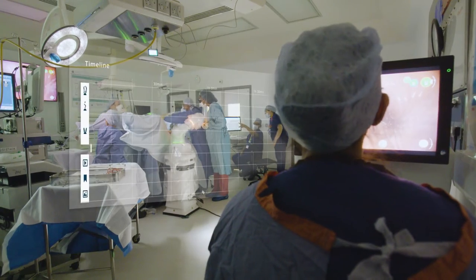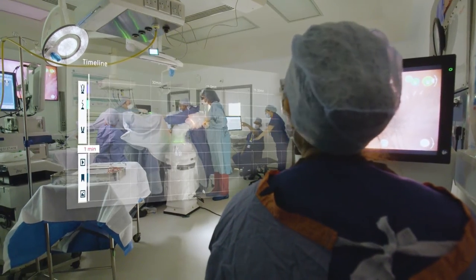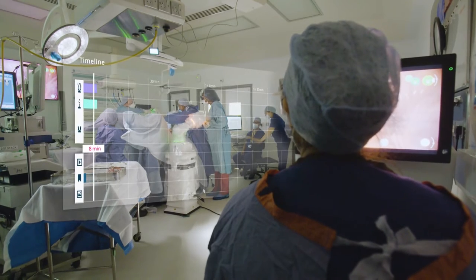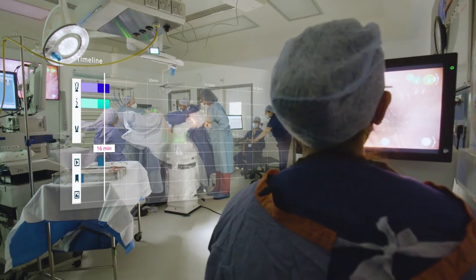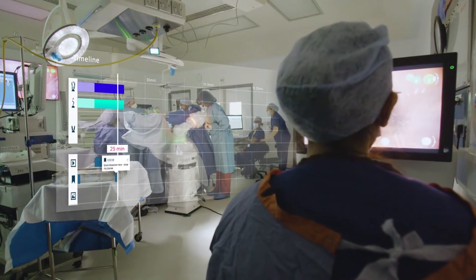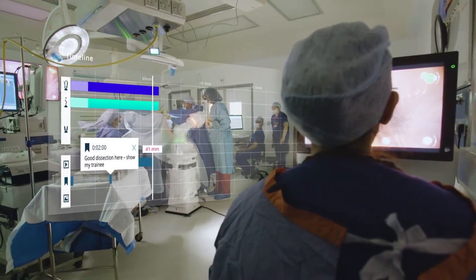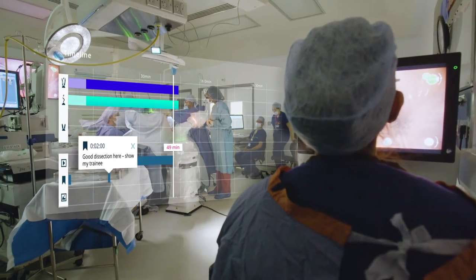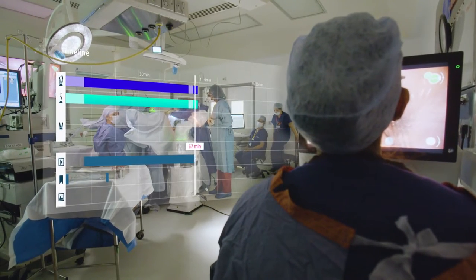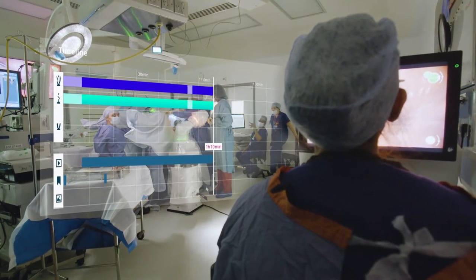Experience rich, intelligently generated surgical timelines with instrument usage, custom bookmarks and uploaded images, all pre-populated.